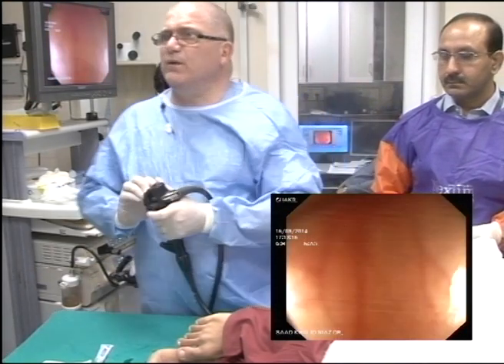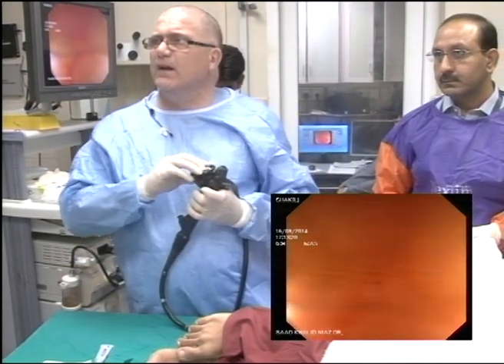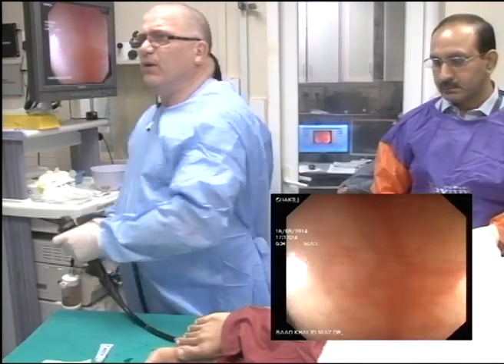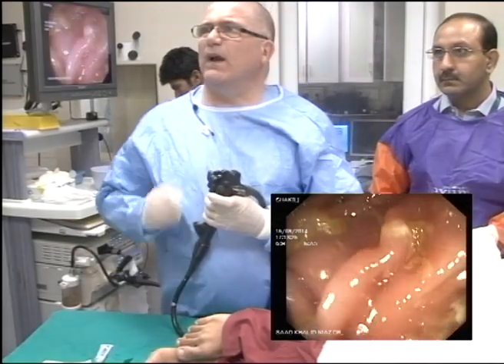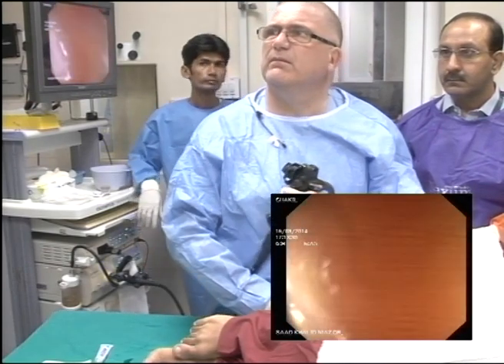Sometimes you just have to use the little wheel to adjust in the right colon when you've got a lot of scope in. Torque steering loses its effect. And sometimes you just have to use the little wheel, which I don't like doing, but I will do if necessary.